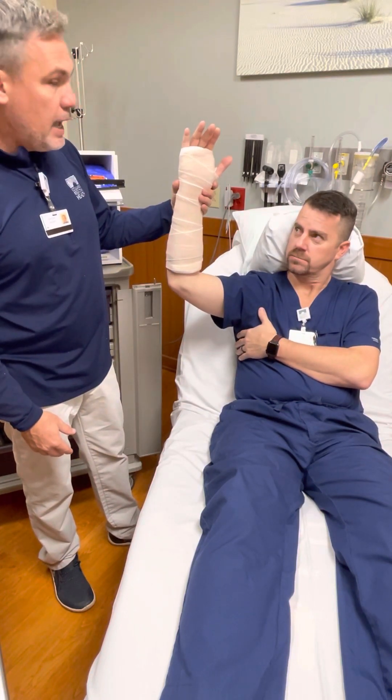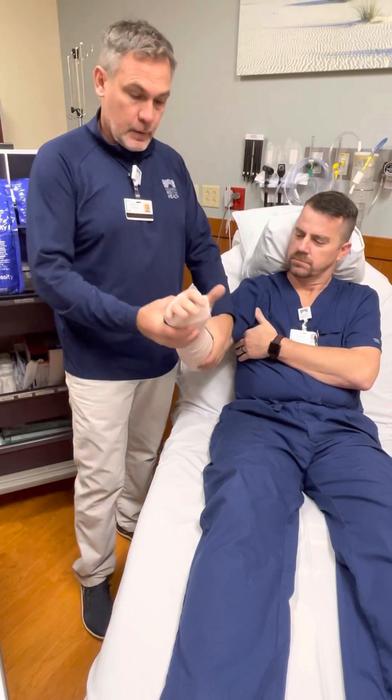And in this case, this is what our typical volar splint should look like.